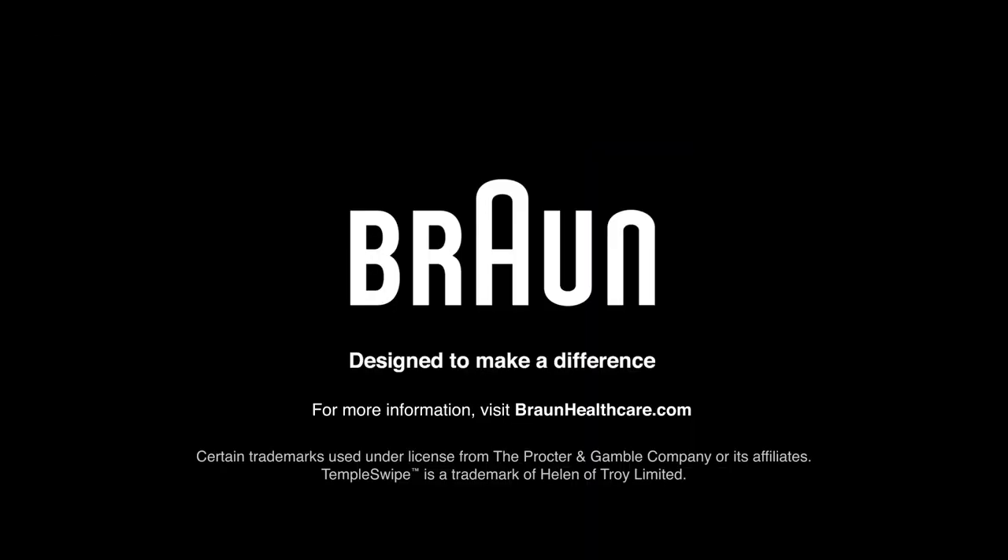For more information on the Braun Temple Swipe Thermometer, visit braunhealthcare.com.